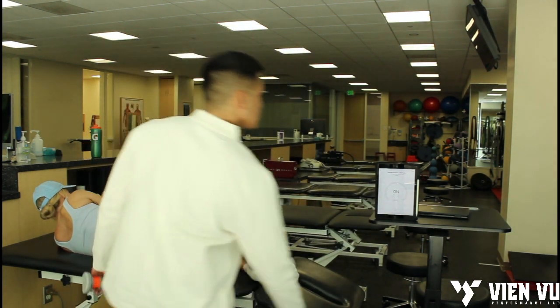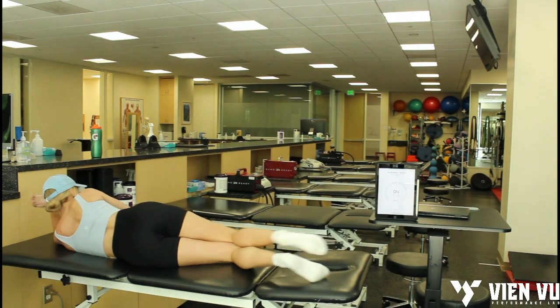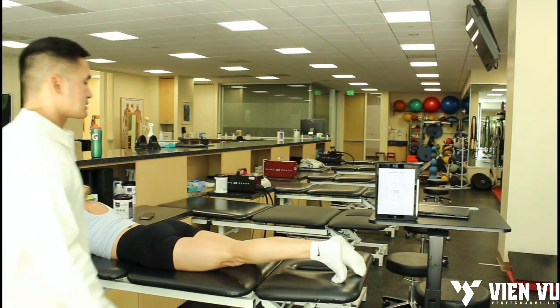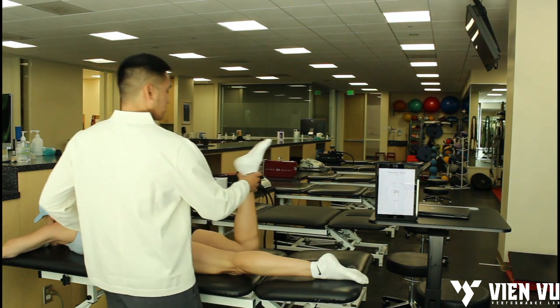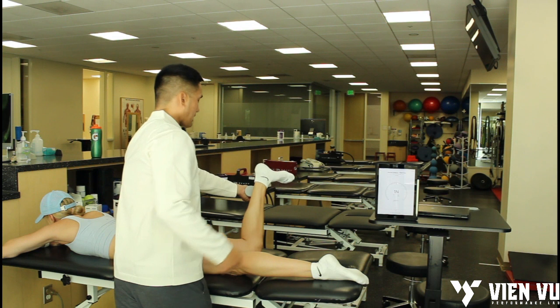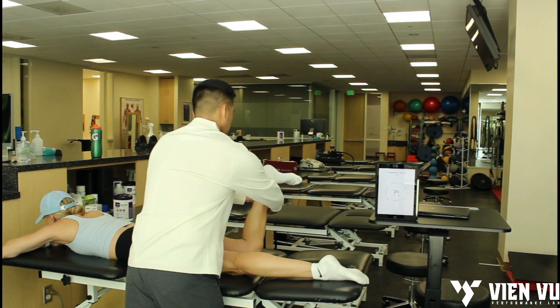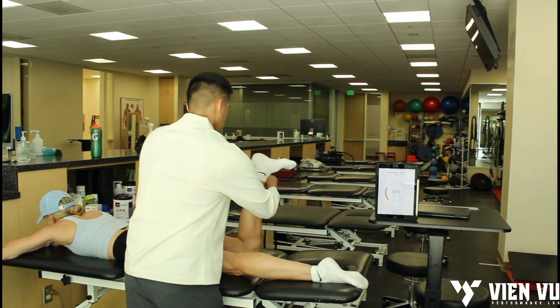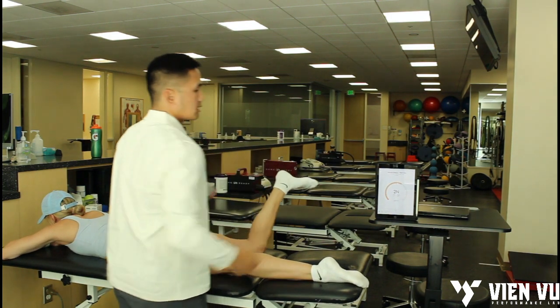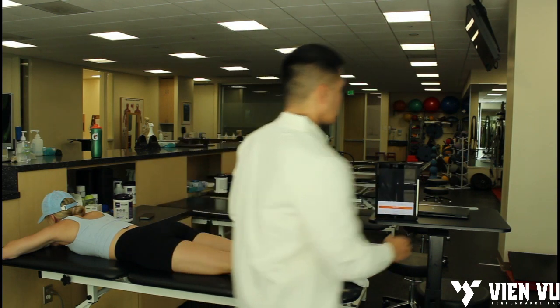This next one is internal rotation on the right side. I'm going to have you lay on your stomach. I'm going to have her bend this way — it's internal rotation, I'm going to start here and go from the outside. I'm going to be in a pulling direction. Ready and go — hold, hold, hold and rest. Good. We're just doing one rep, so I'll go to Next and go to the other side and hit Start Testing.